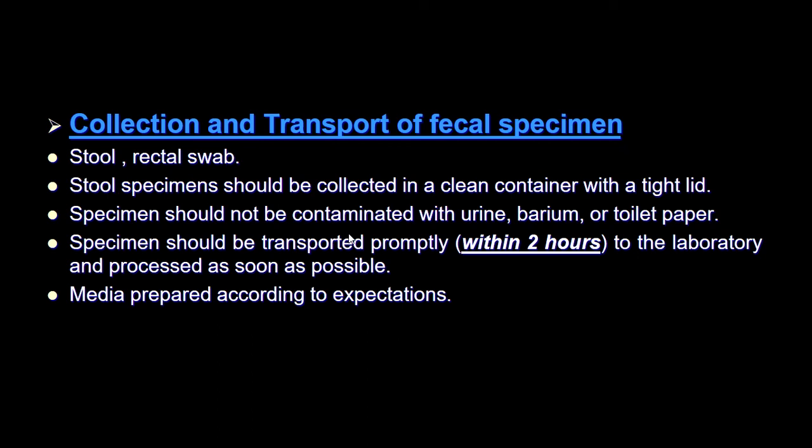The specimen should not be collected with the urine. The specimen should not be mixed, because the urine could contaminate the specimen, or it must not have barium meal and enema, following an X-ray done to the gastrointestinal tract.